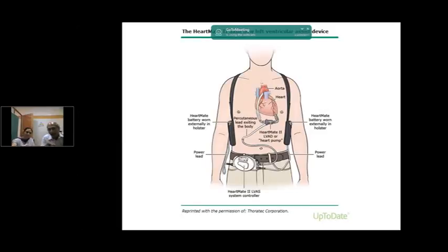Now, apart from that, they have a drive line, and we see this drive line is connected to a control unit. This is the brain of the pump, where every data is available, how it functions. From the control unit, there is a backup which has to be connected to an electrical device or to a battery. In this case we can see they have complete portability: the patient is holding a jacket with a battery, and is more mobile.